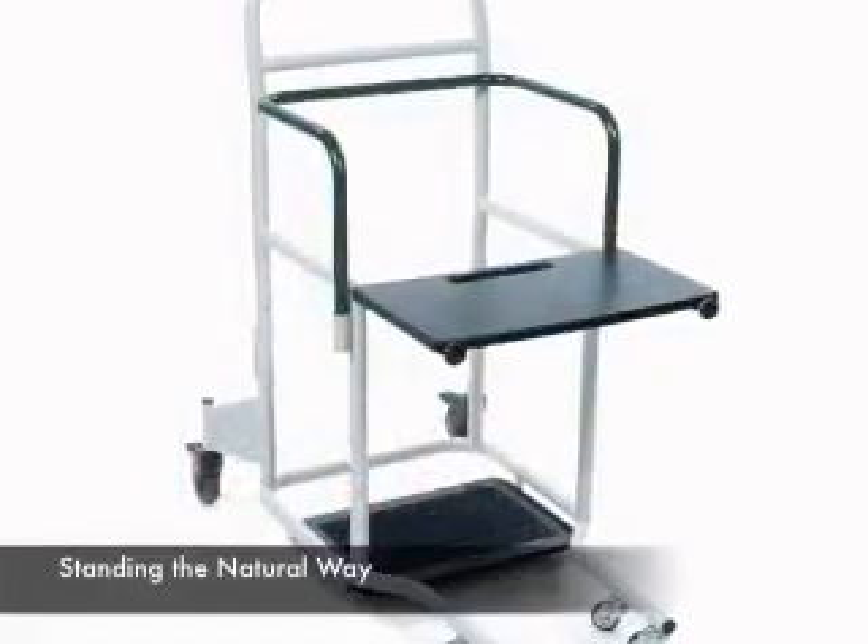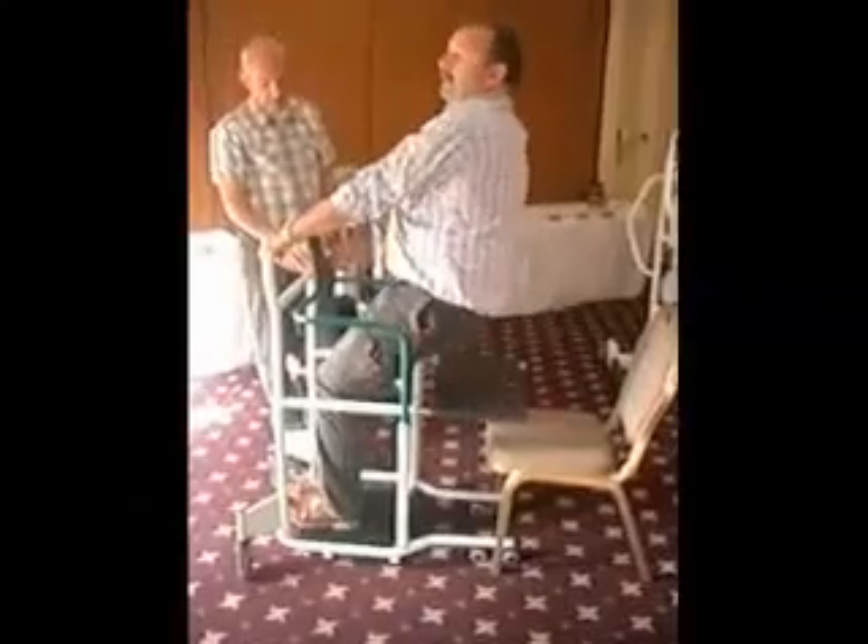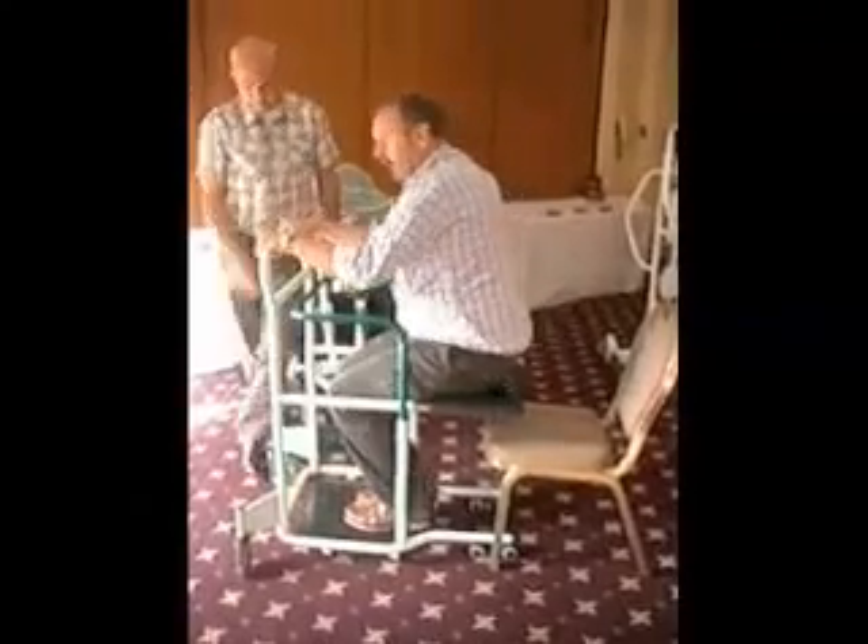I am a little bit tired. Don't put the feet to the front because then you are hanging just to the back and you cannot stand.